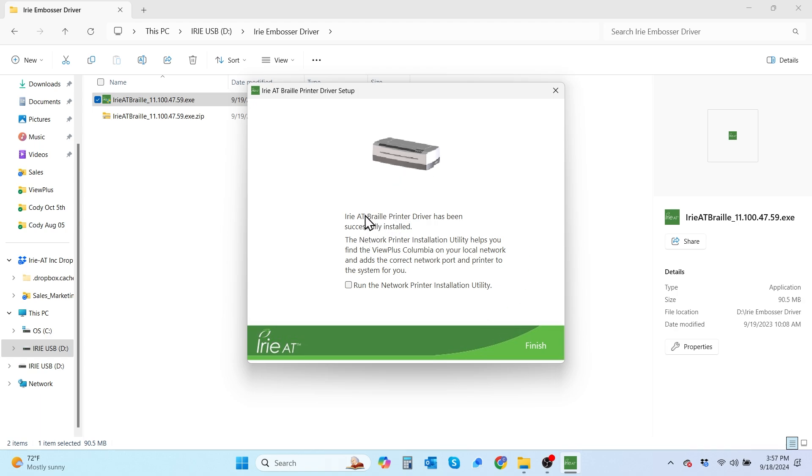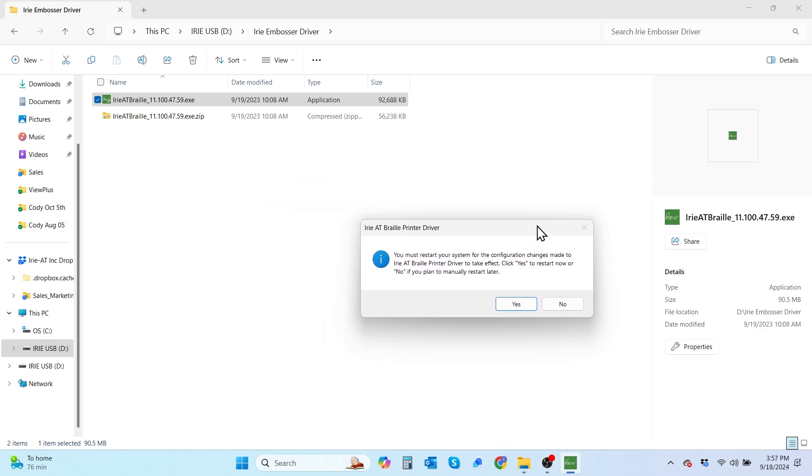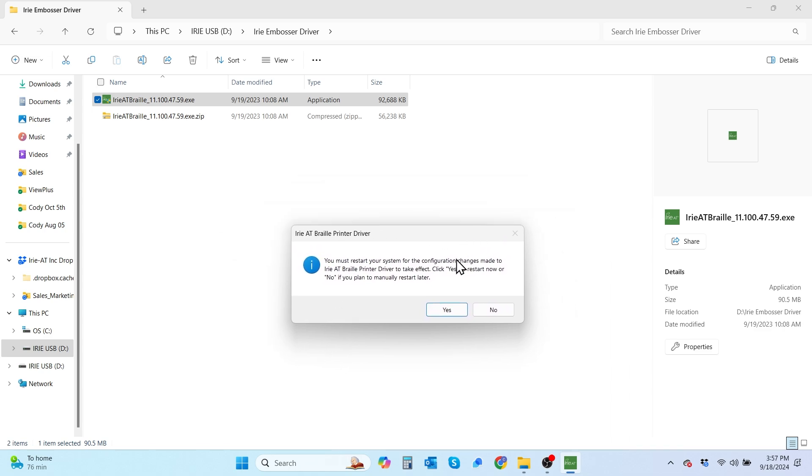We're going to select the finish button to finish the setup. Then it takes us to the screen letting us know that our Irie AT Braille printer driver has been successfully installed. There is a checkbox to select to run the network printer installation utility if you do want to network your embosser, but for now we're just going to connect via USB. So we're going to select finish. Now you're going to get a dialog box that prompts you to restart your PC in order to properly install the driver — we're going to hit yes and reboot.